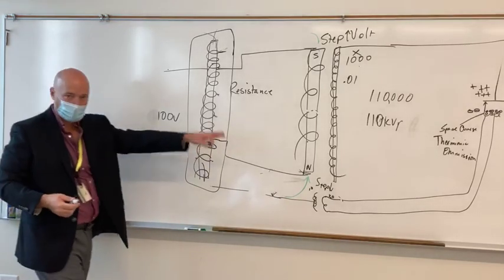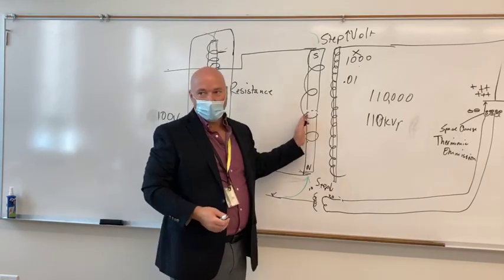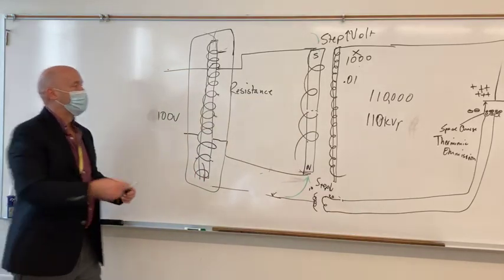Okay, so each one of these are in its own oil bath. Maybe not this one, but this one absolutely has to be. Okay, so we got oil inside of it to reduce the resistance.